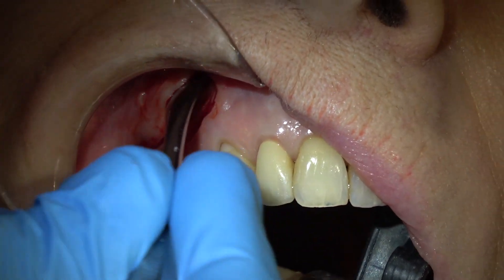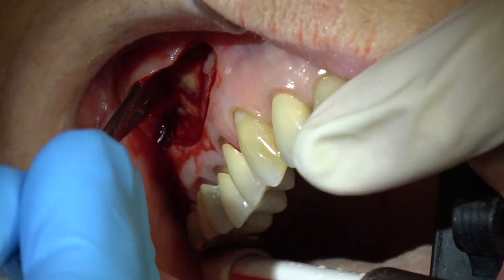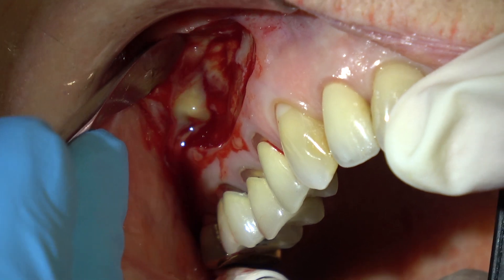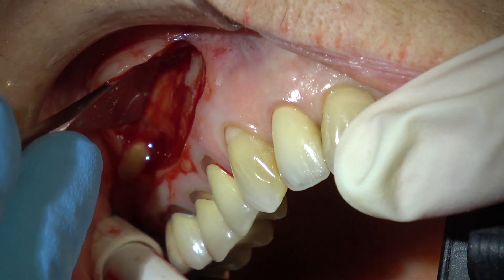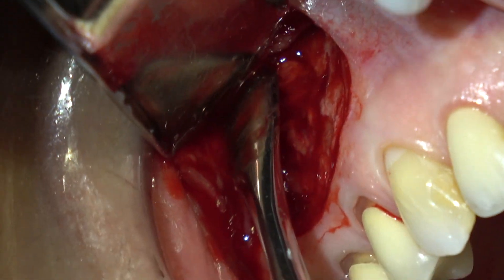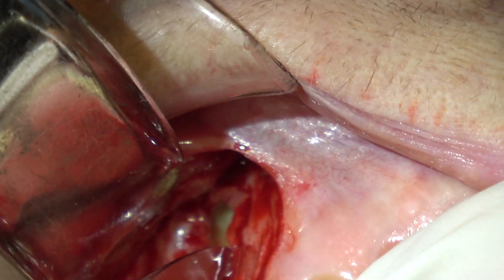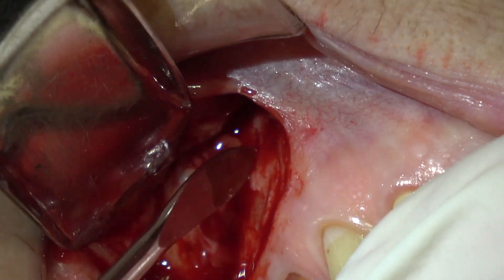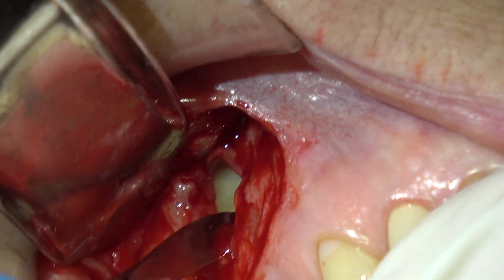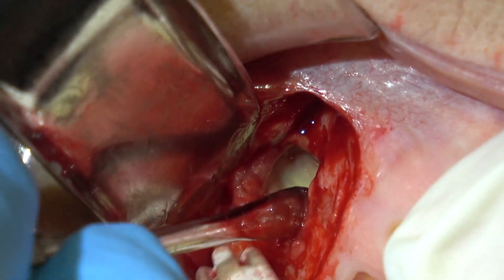Look at the purulent exudate pouring out of that lesion. Oh, can you imagine how good that feels to the patient to get rid of that? This is not a complicated procedure if you know what you're doing. Just reflect enough tissue that you've got access, and then you're going to clean all that infection and granulation tissue out of the site, and then you're going to cut off the tips of the bicuspid teeth — apicoectomies — and retrofill them. See all the purulent exudate.